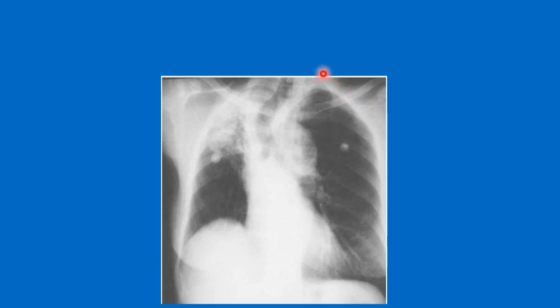In this X-ray, we can see this is the trachea and there is an abnormal anatomy of the tracheobronchial tree. So this patient will be facing difficulty in endobronchial intubation. So this is why this preoperative chest X-ray will be very useful.